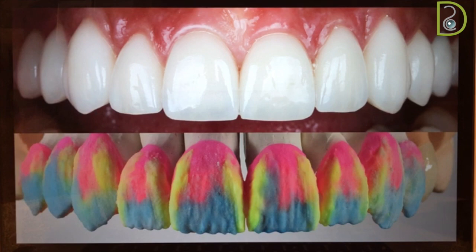All you need to do is check the margin and fitting surface. If you have any problem in your fitting surface, just use the fit checker and remove a little bit from the tooth itself, not the veneer. Adjust your proximal contact and occlusal contact with porcelain polishers. Some final occlusal adjustment can be done after cementation, but these are the things you need to keep in mind and check before you go ahead and start your cementation. Put it with the try-in paste we just showed over here.